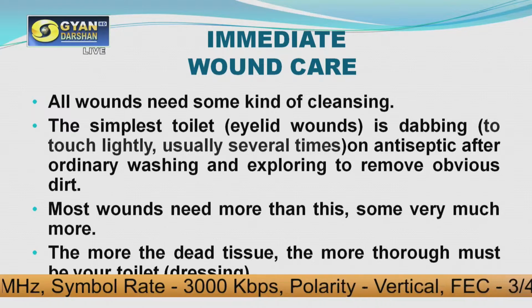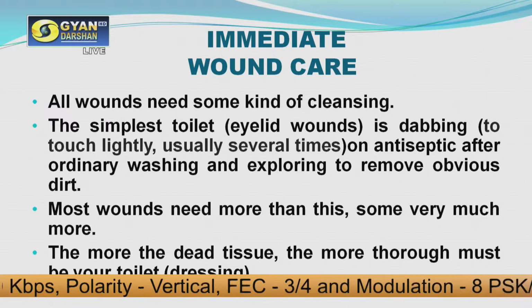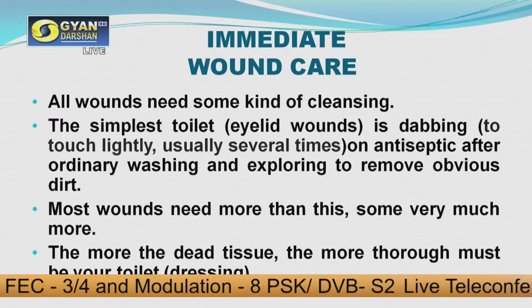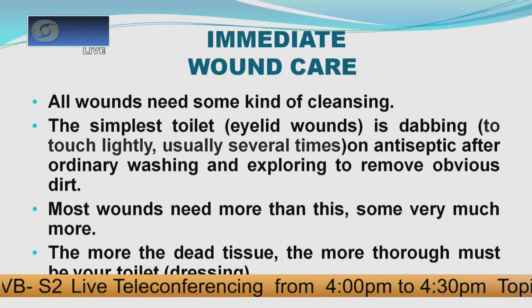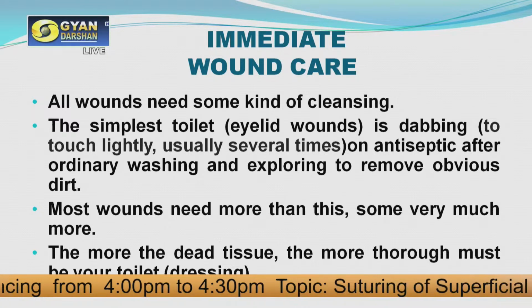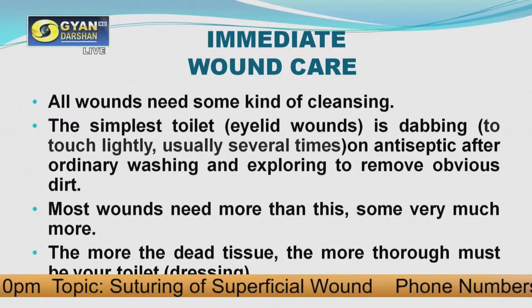Dabbing means you touch the wound lightly, and usually you do the dabbing several times. So whatever dirt was there in the wound can be removed. After doing the ordinary washing, it has to be dabbed, which will help remove the obvious dirt if it is there.